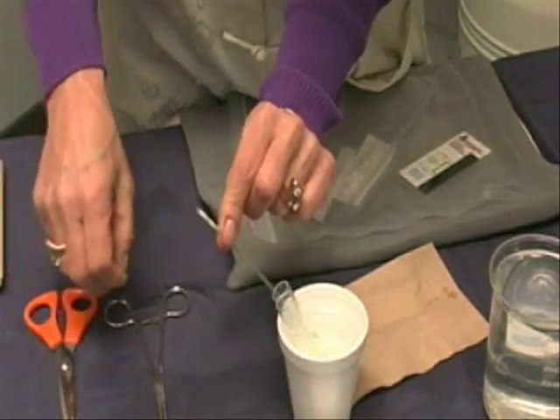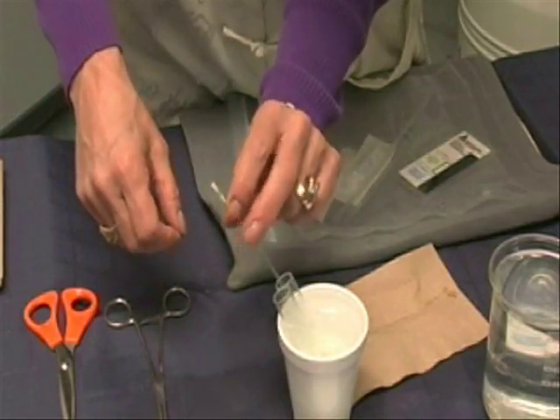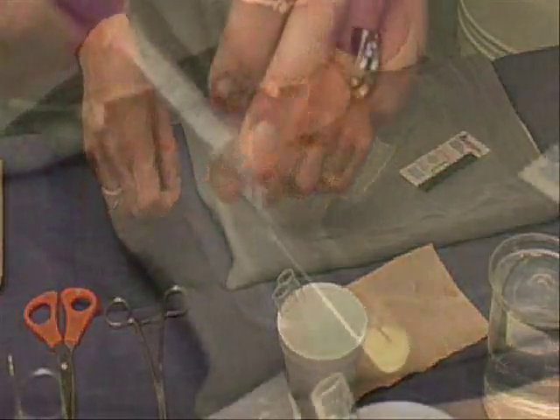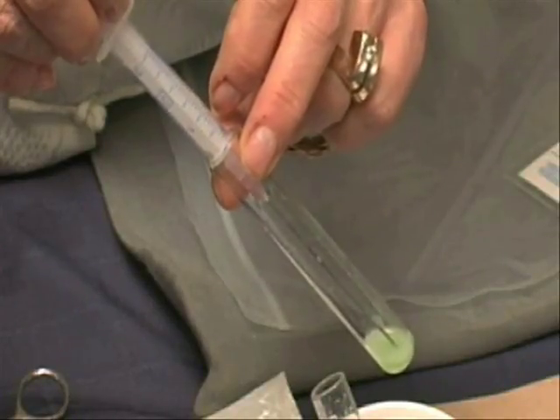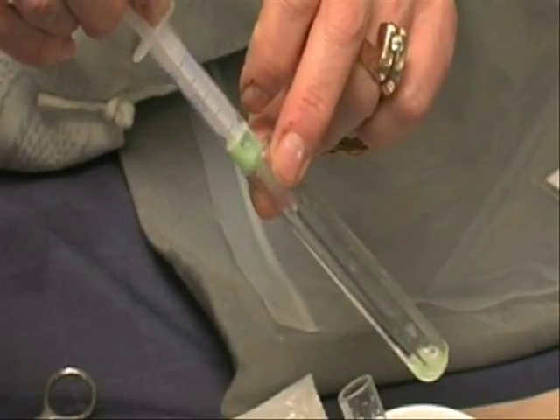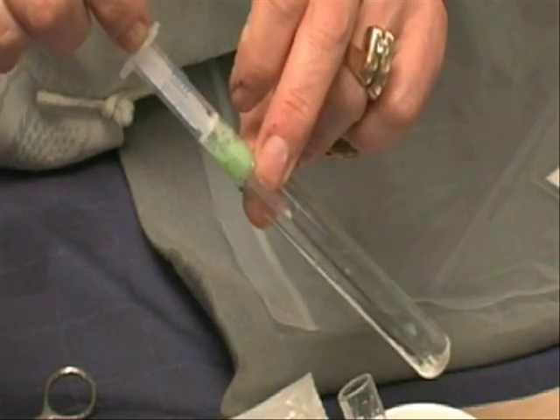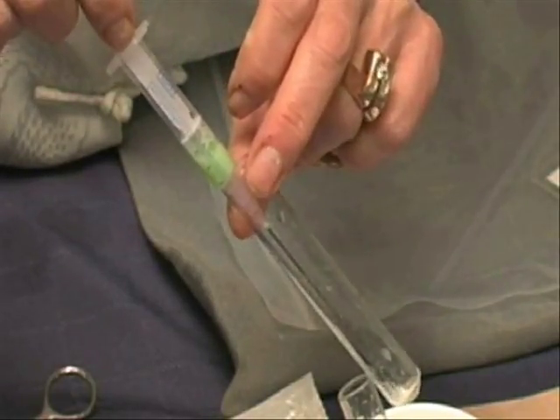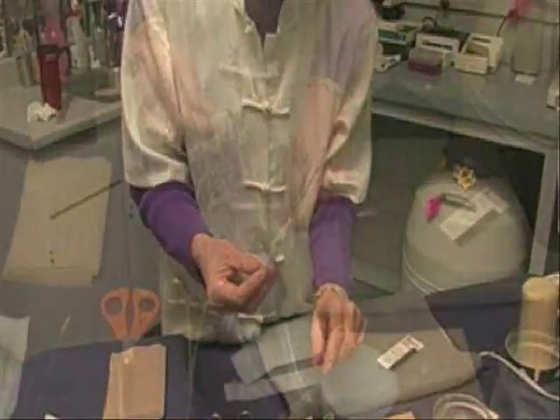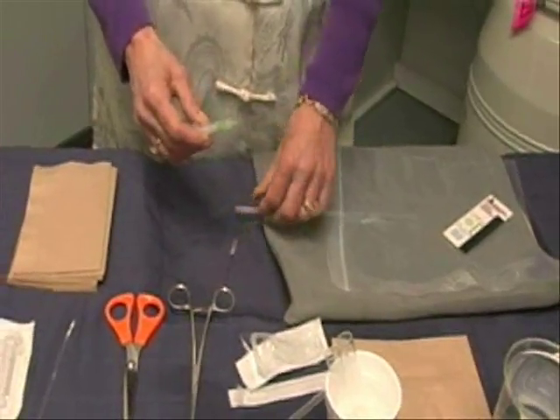Let combined semen and thaw media stand in the glass culture tube for 2 minutes in the 37 to 38 degree centigrade water bath. Draw up with large bore needle. Replace needle with the insemination rod.